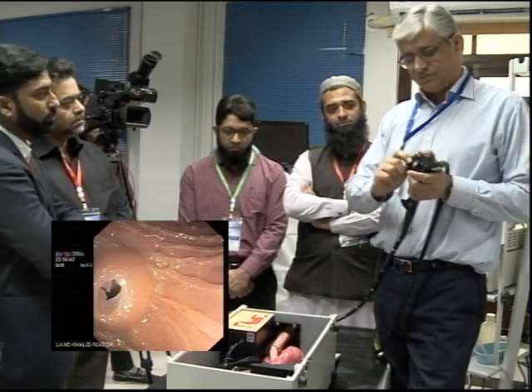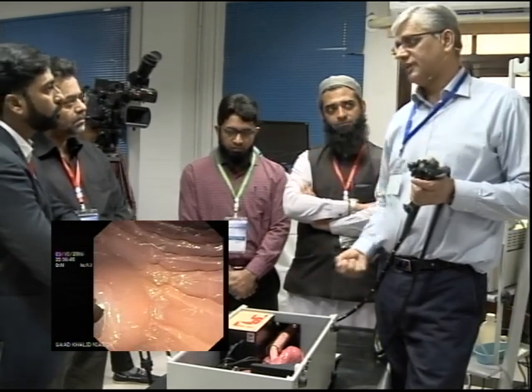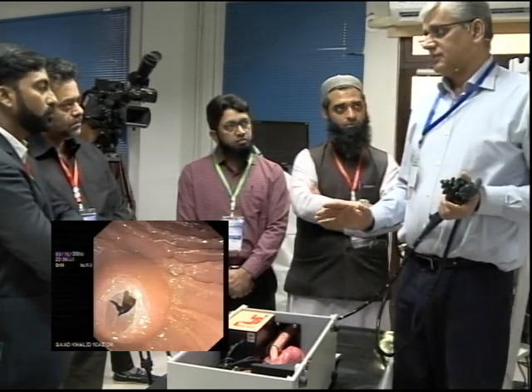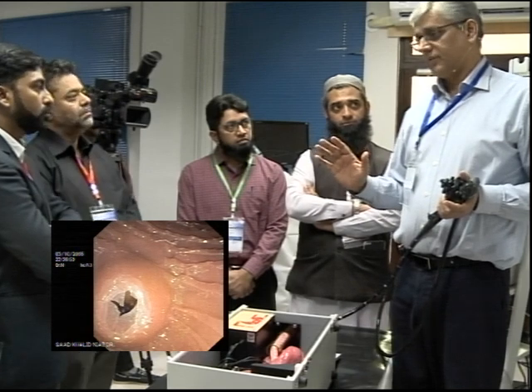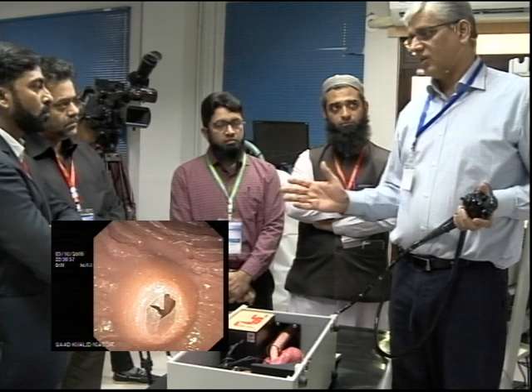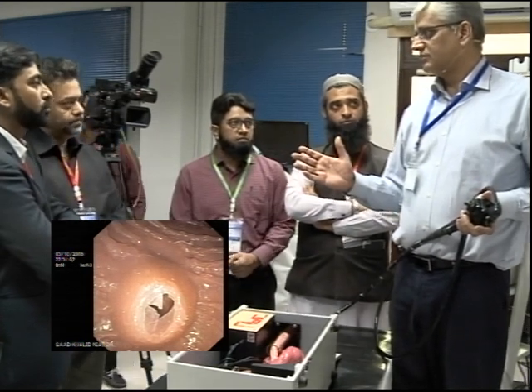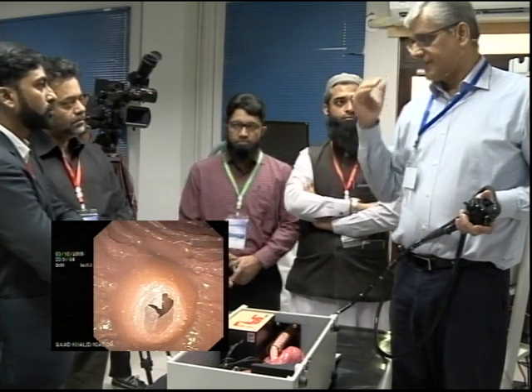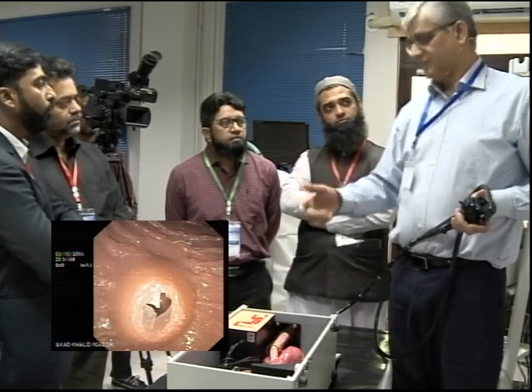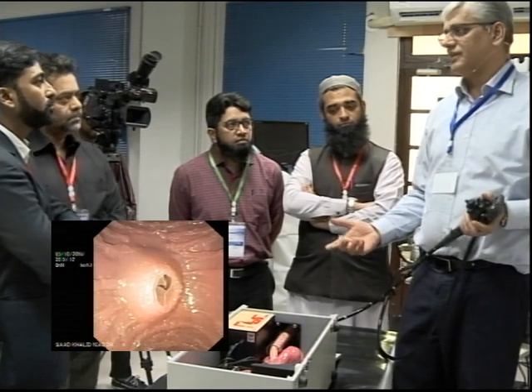Lock this right back, clockwise rotation and back. Please don't start pediatric cases, my advice, okay? Because it's not fair, not at least until you're totally comfortable with adult. Please don't. And the second thing is, if you're going to be doing it, be very gentle. There is no time race here.